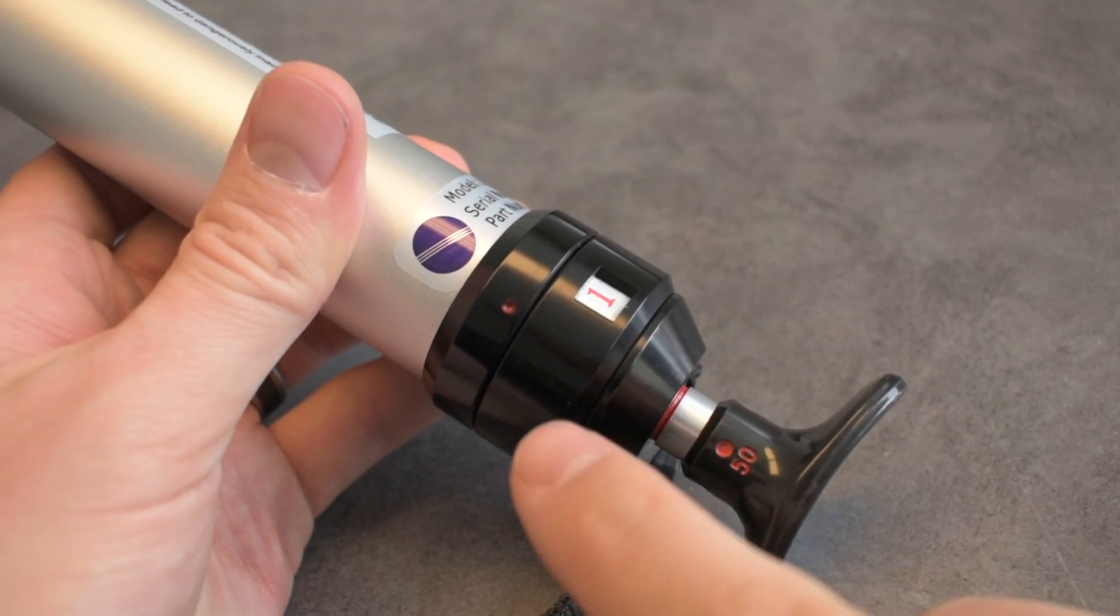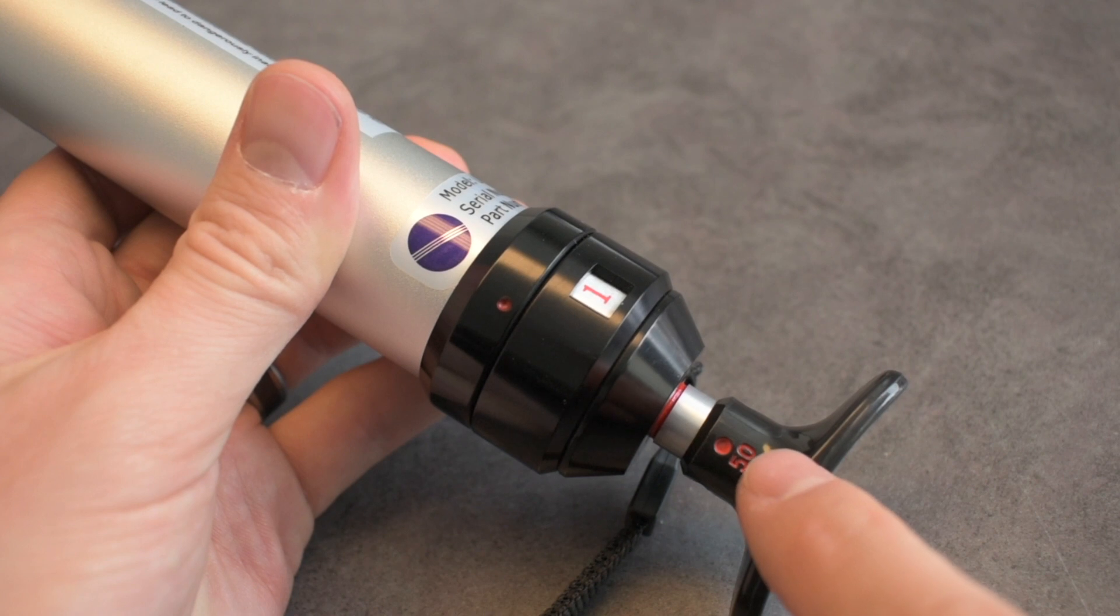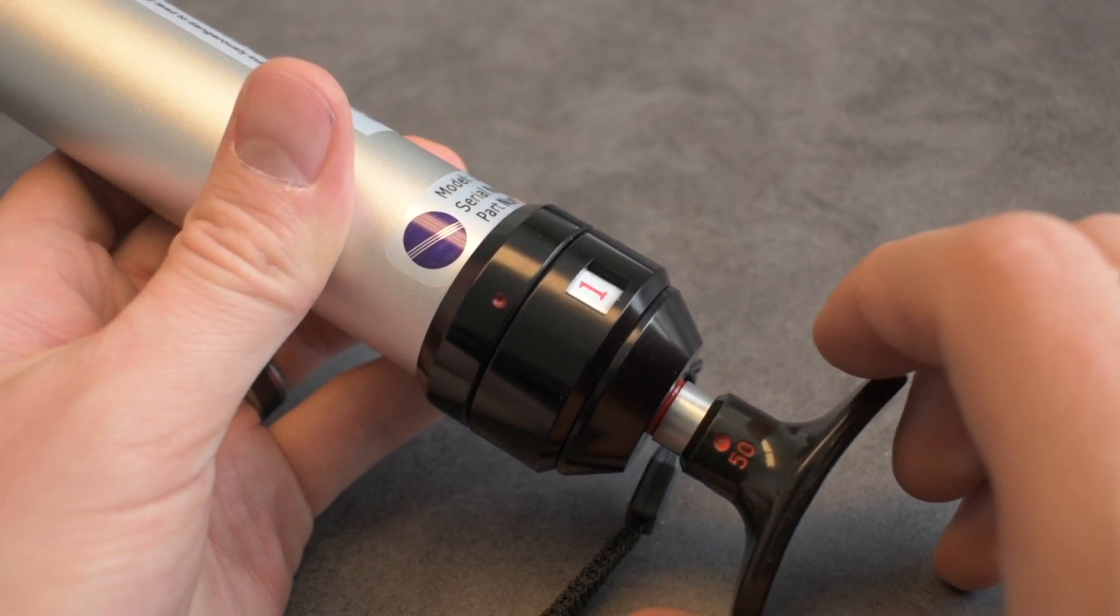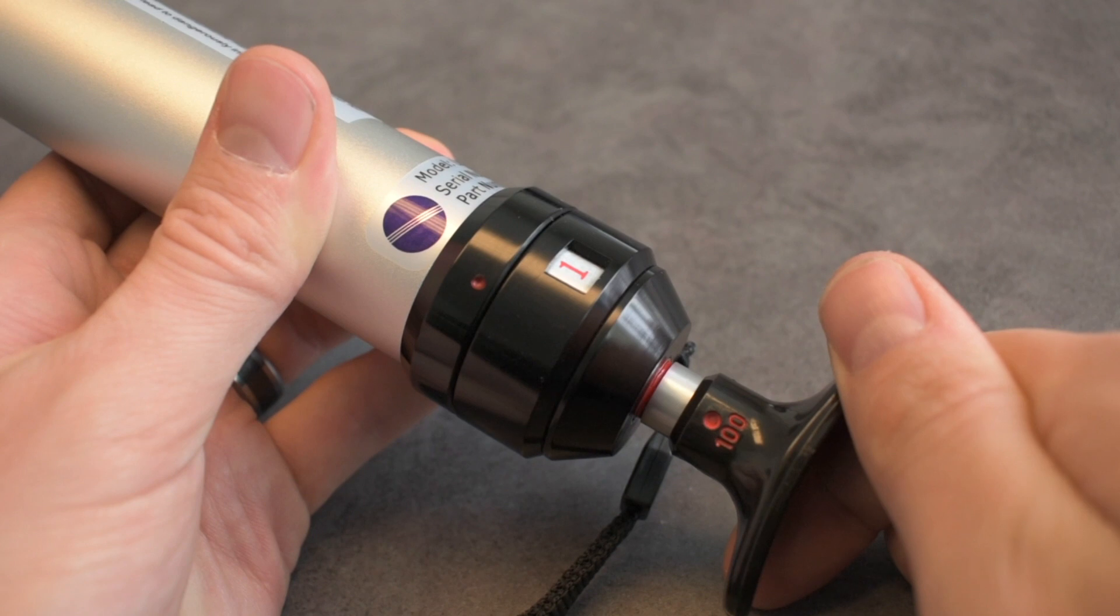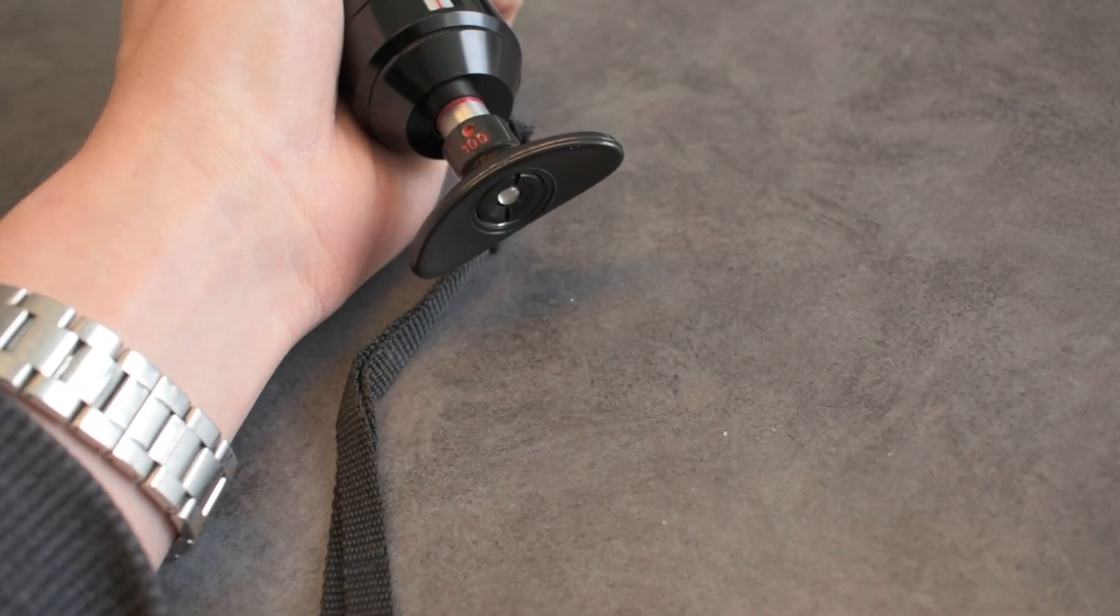The dot on the handle and the dot on the body of the pump need to be lined up. The dot on the handle will also have a 50 or 100 on it. If you have it on 50, that means it will only take a half draw stroke. If you have it on 100, it will take a full draw stroke.